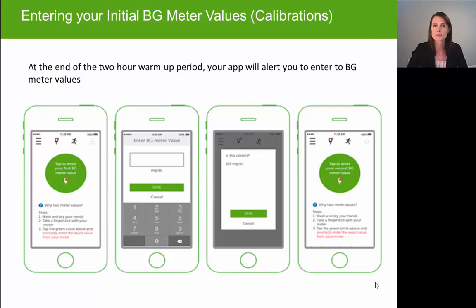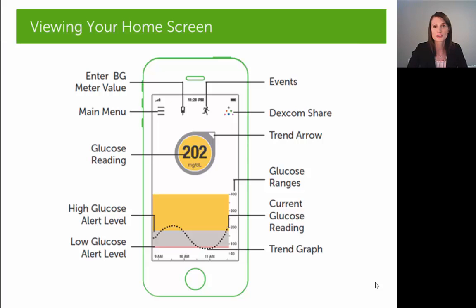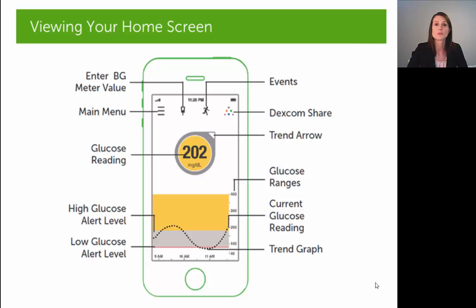At that point your Dexcom G5 app will start to read your glucose, and you will see a glucose reading at the top of the home screen. At the bottom of the home screen you have your trend graph, which plots your glucose as data points as you progress through your sensor session. Above that trend graph you have your current glucose value, and surrounding that value you have your trend arrow indicating the speed and direction of your glucose — a feature very unique to a continuous glucose monitor.